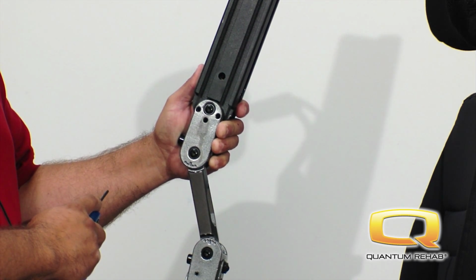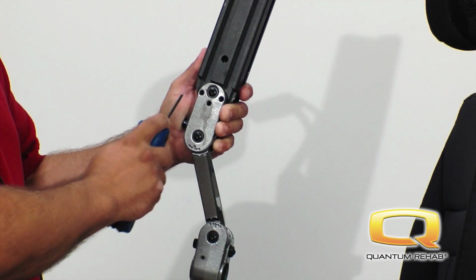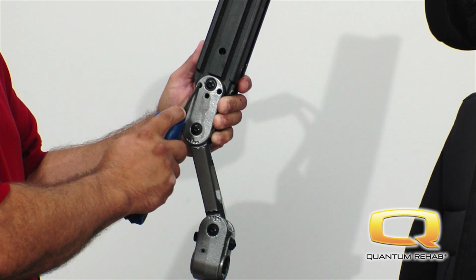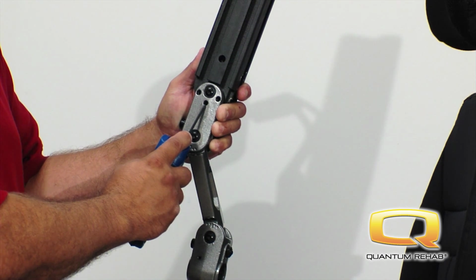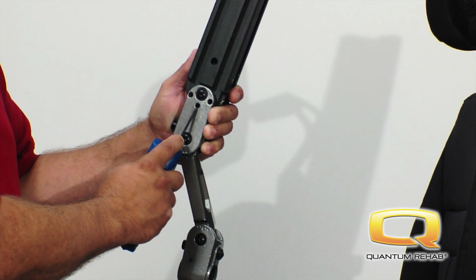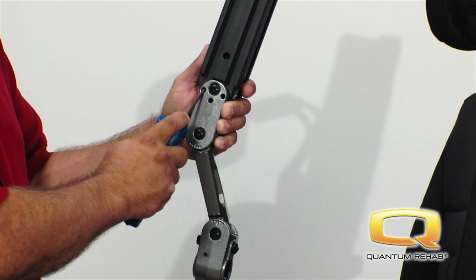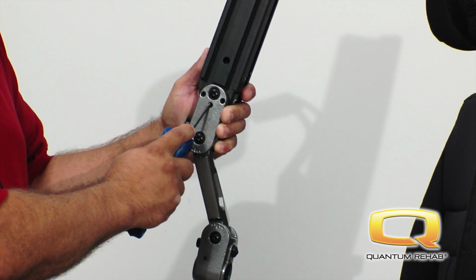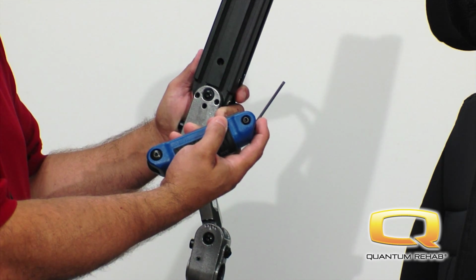However, some patients may want the arm set on the inward location or set for an outward location. Let's assume this is a right arm. If you want the arm to flex in, you want this set screw to remain there. You want to remove this one, relocate it right here, and depending on whether you tighten it down or keep it loose, the arm will flex in or will be rotated in and permanently locked in position. Conversely, if you would like the arm to go in the outward direction, you would keep that set screw in place, remove this one, relocate it there, and again, depending on whether you lock it down or keep it loose, the arm will then flex or remain locked in place in the outward direction. The tool required is a 3mm Allen key, which can be obtained at any hardware store.